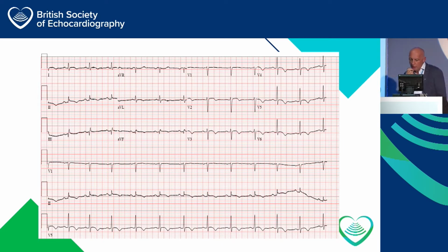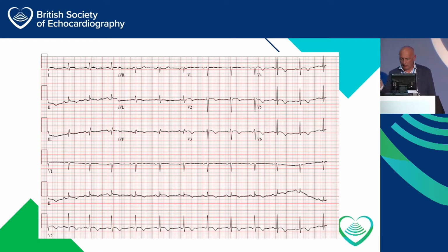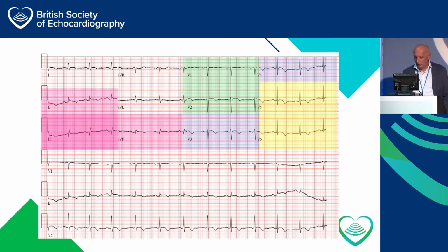And the conclusion was, this is probably inferior, anterior, lateral dynamic ECG changes. So the patient's going to go to the cath lab. Okay, pretty sensible approach to things. That's what you're going to do with the troponin rise. This is to just remind me of the areas on the ECG, inferior, septum, anterior, lateral, just in case I forgot them, but I managed to get through them.